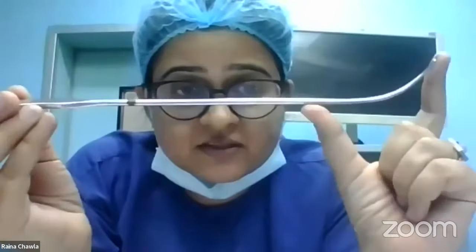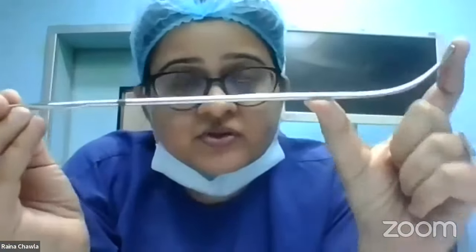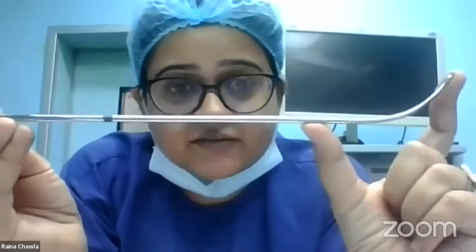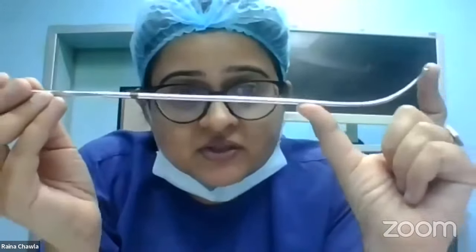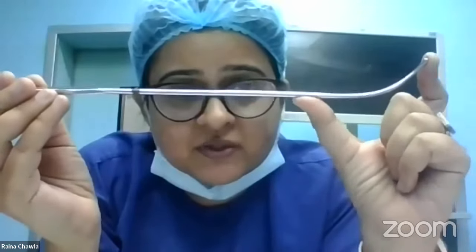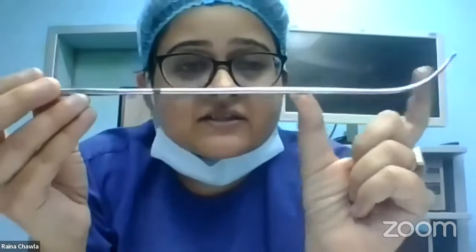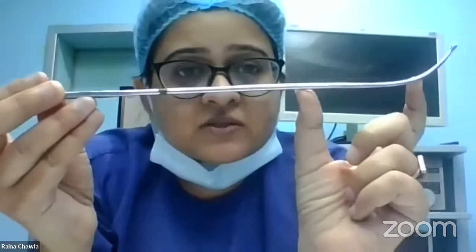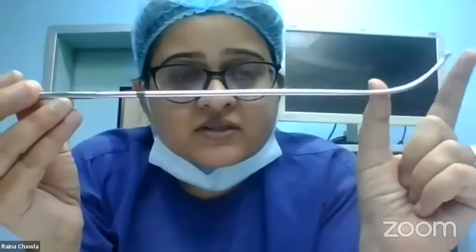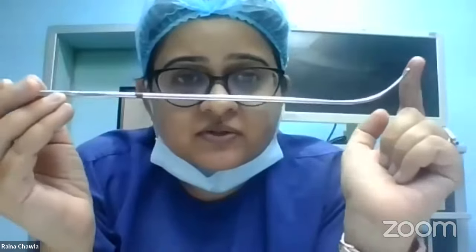For example, if we're inserting a copper T or an intrauterine device, we will sound the uterus to see the length of the uterine cavity. If we're examining a patient with, say, cervical elongation, a patient with prolapse, and you're suspecting cervical elongation, you will measure the distance from the internal os to the external os with the sound, and then the internal os till the fundus of the uterus. So this is where you'll use a sound.